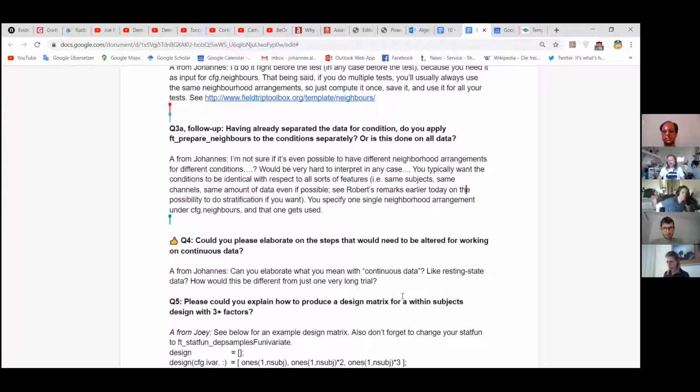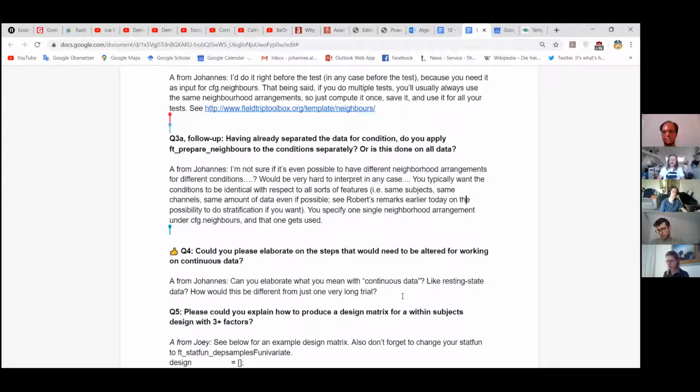Can you do the same also if you, for example, would have different systems across subjects? You technically could do that, I guess. If you compute a spatial filter, for example, and you sample that at predefined locations, you could do that. But it's quite a strong assumption that your estimation of the spatial filter works well or is comparable across systems.